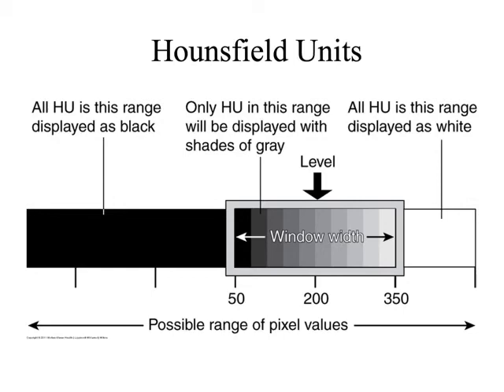There's one other thing that might be important to talk about in thinking about these Hounsfield units and understanding these attenuation profiles, and we're going to call this an ROI, a region of interest. We can define an area on a CT image, circle it, and it can tell us the attenuation value for that area, in Hounsfield units.